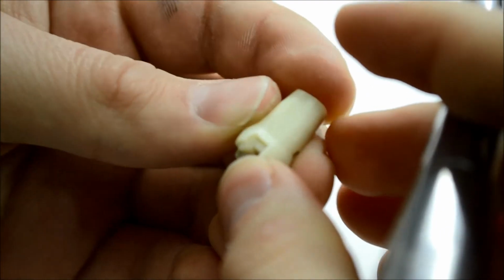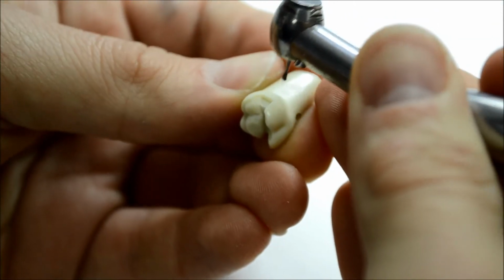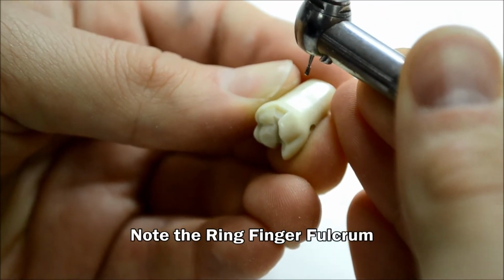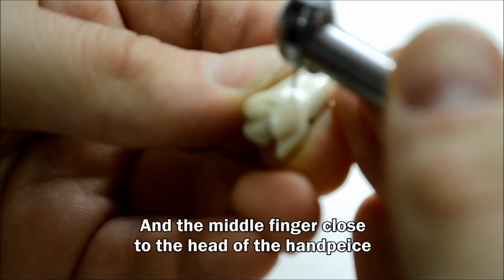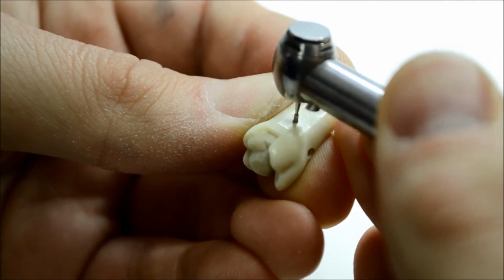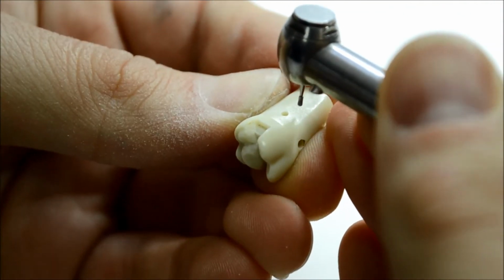So for example, if I'm making a depth cut, just going straight into the tooth, I want to go up and down, not just plunging the burr right in. So I'd want to do this, rather than going in straight like this.